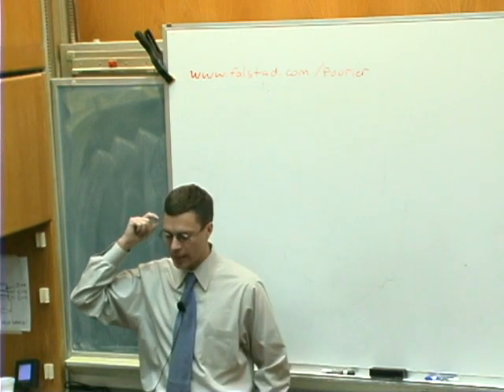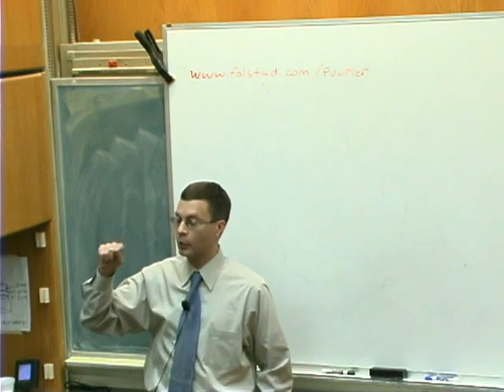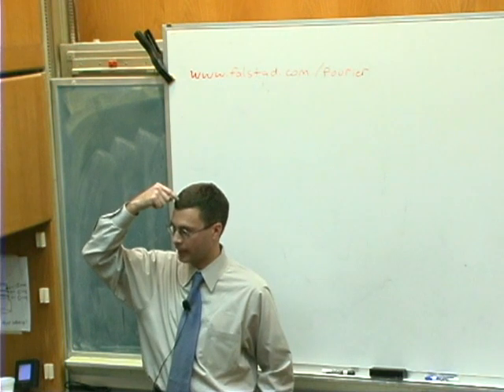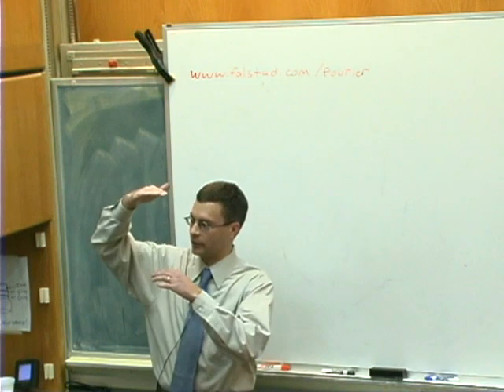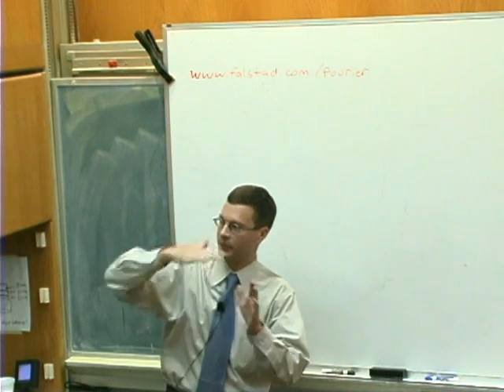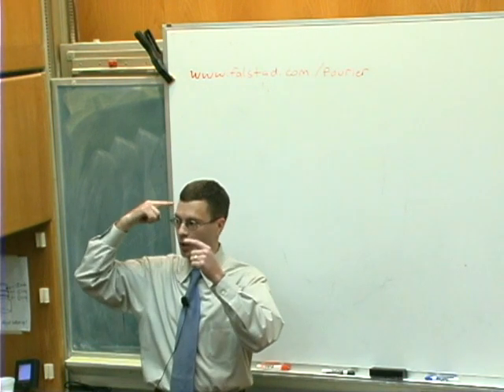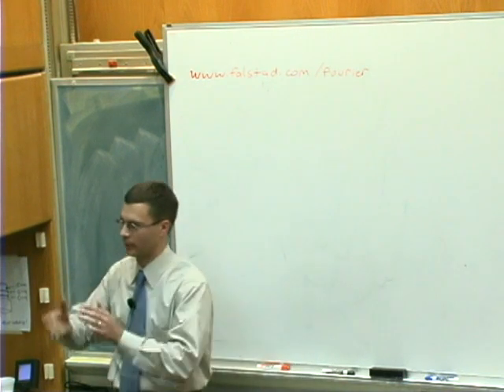Actually, our aim at that time was to try and model the global signal change, which we'll talk about in a moment. It turns out the 1 over f noise in the water jug phantom is of a very similar shape to the noise you see in the tissue of the brain, although it's a little different in amplitude: human brain tissue has a slightly increased 1 over f amplitude compared to the water, but its inflection shape is the same. But disappointingly, the global signal fluctuation is quite different between the water and the human brain tissue, which means there's another source of noise, which we'll talk about in a minute, that you can't remove by doing that trick.